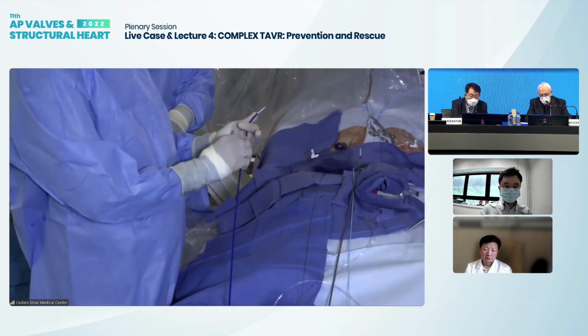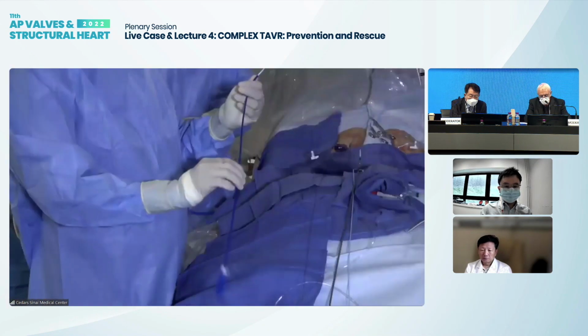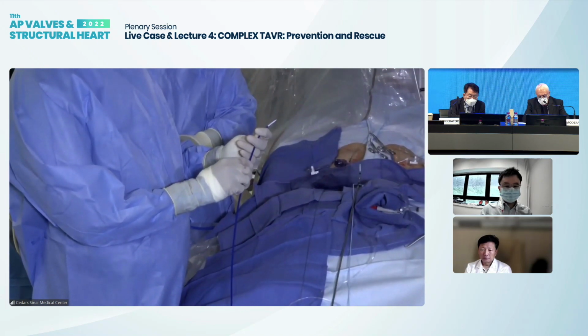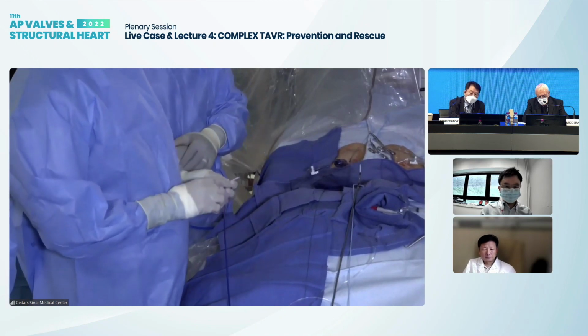Is our right atrium large? The right atrium is large, yes. Okay, in which case we would give more shape. But in this case, when we did the transseptal, we didn't really have to do that.